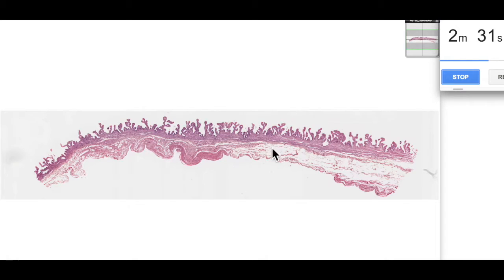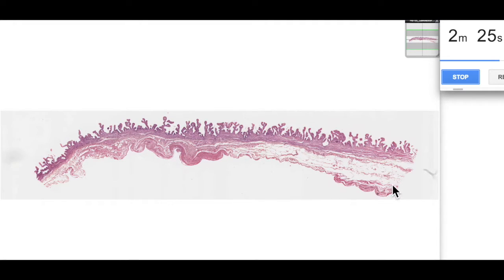And then we have a serosa or an adventitia, depending upon where the section's been taken from. So if it's a serosa, it has a mesothelium, which this region does, or if it's an adventitia, it's a connective tissue.